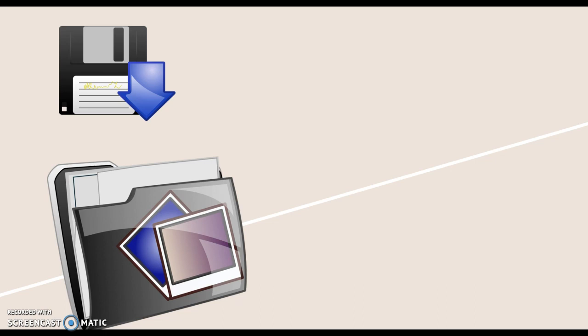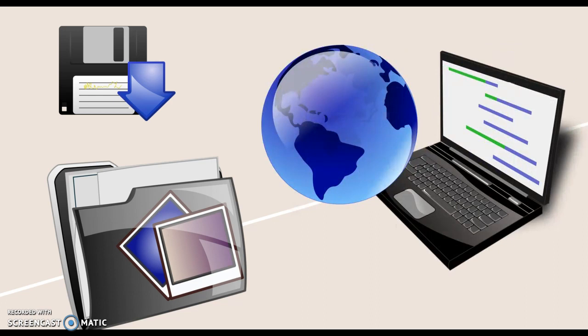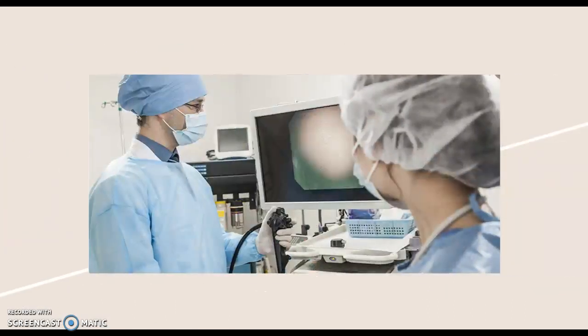After the procedure, the data recorder worn around the waist is returned to the office so that images can be transmitted and examined. Failure to follow the directions may mean your capsule endoscopy may need to be rescheduled and done again. Mayo Clinic authors remind patients through the informative article on the topic. As mentioned previously, the procedure allows for images to be transmitted on the computer and later viewed by doctors from all over. Generally, test results are discussed around a week after examination. Capsule endoscopy is beneficial because it can help to identify complications before they progress.